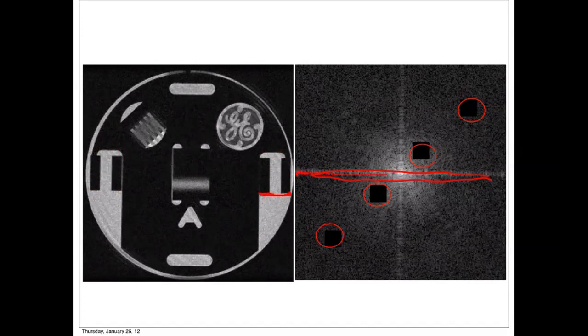This spread over here, that's because of edges in the vertical, like in this direction. All these edges are very, very strong, and they create high frequencies along this dimension. And so you can kind of see that in this whitening on the frequency domain.